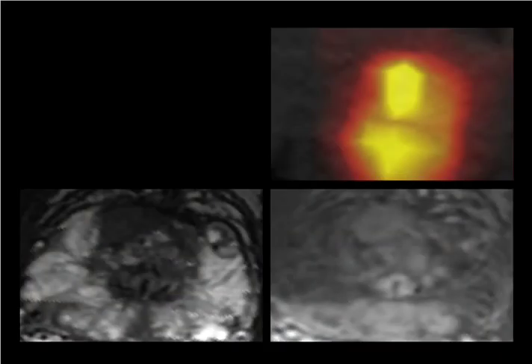But when we look at the PET image and reconstruct the slice of the PET image that has the same orientation as the histology that we're about to look at, and we've constructed this using the methods that we've developed for co-registration, when we look at this slice, we see corroborating evidence between the PET and the MRI. So we see a hotspot on the anterior that could direct the focus of someone making contours towards the anterior, where they might see these subtle signs of prostate cancer on the anterior side.